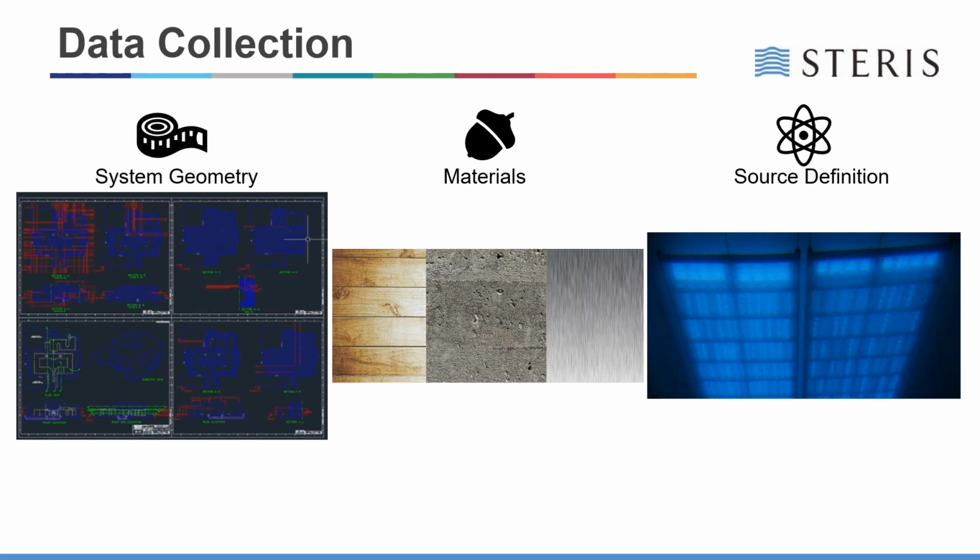For something like aluminum, you would see more like 30%, and if it was steel, that goes down to about 3%. So this really shows you that appropriate assignment of materials to the components within simulation is especially important in order to produce an accurate result.